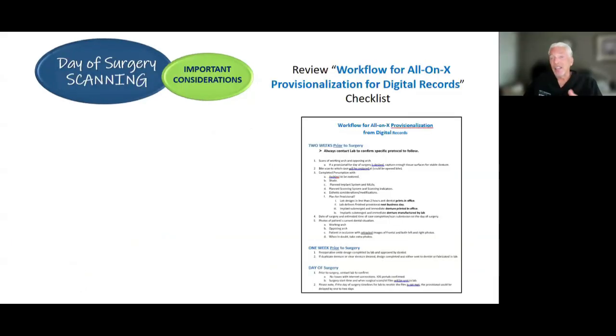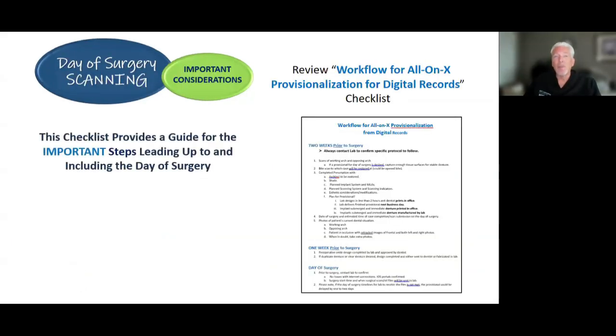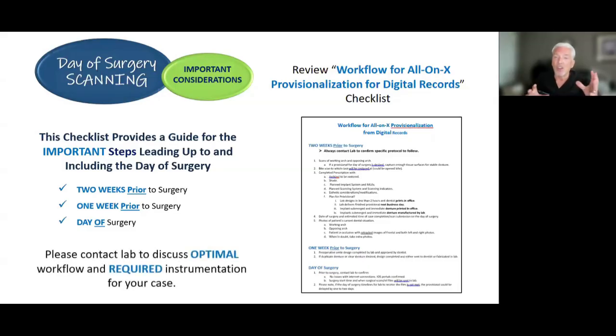We do have a nice little checklist available for you that walks you through some of the timelines, like what to do 2 weeks prior, 1 week prior, and the day of surgery, so that you're not surprised with any of this. And I cannot stress enough, my friends, talk to your lab ahead of time and get a good dialogue with them.